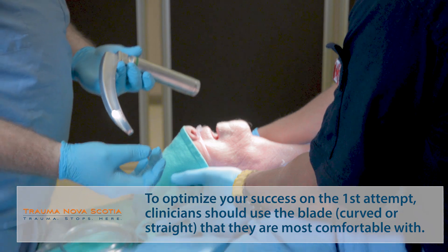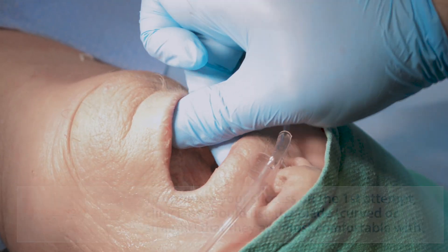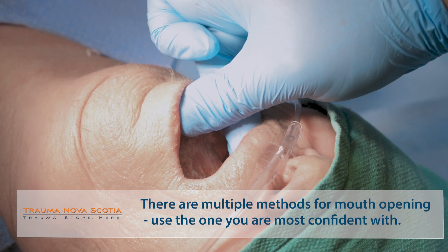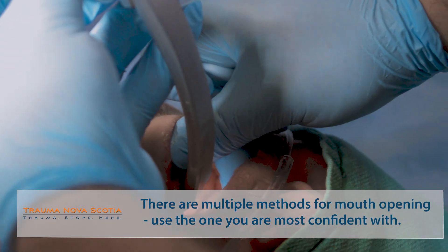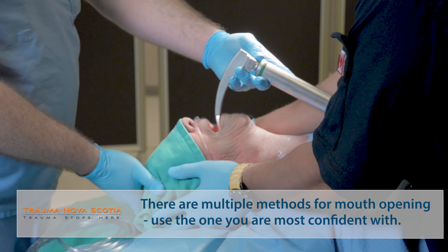The initial step is using your right hand — your dominant hand — through a cross-finger mouth opening to create some space and get the teeth out of the way. At this point, the blade is introduced onto the patient's tongue in the midline, and the right hand comes off and moves to the back of the patient's head.